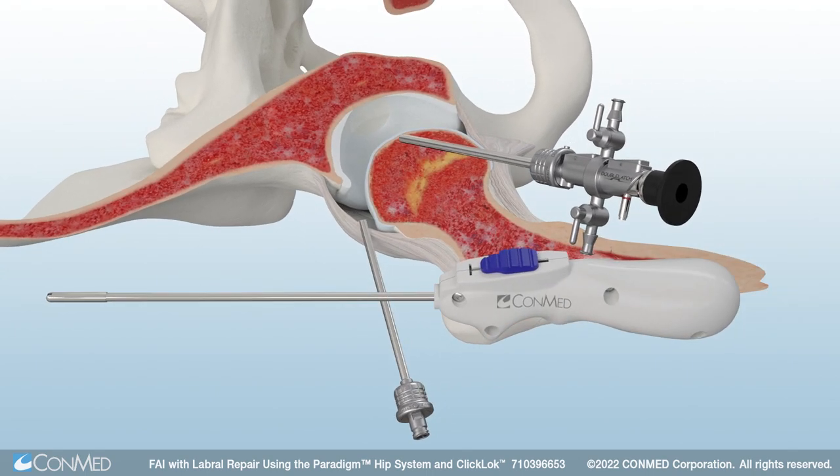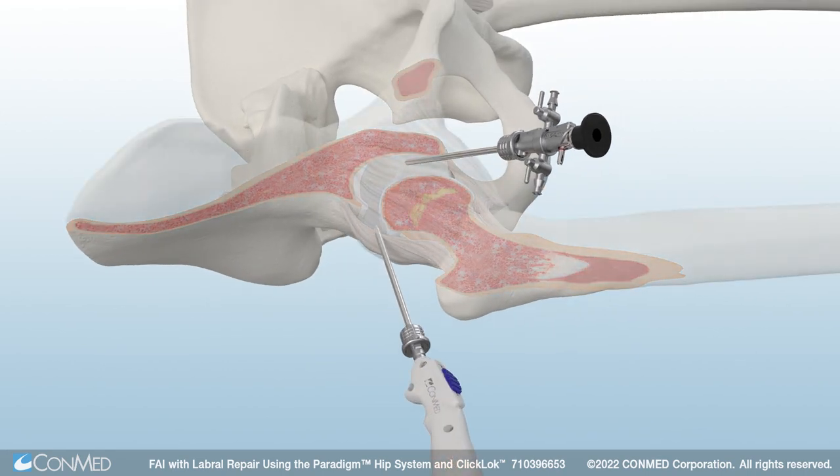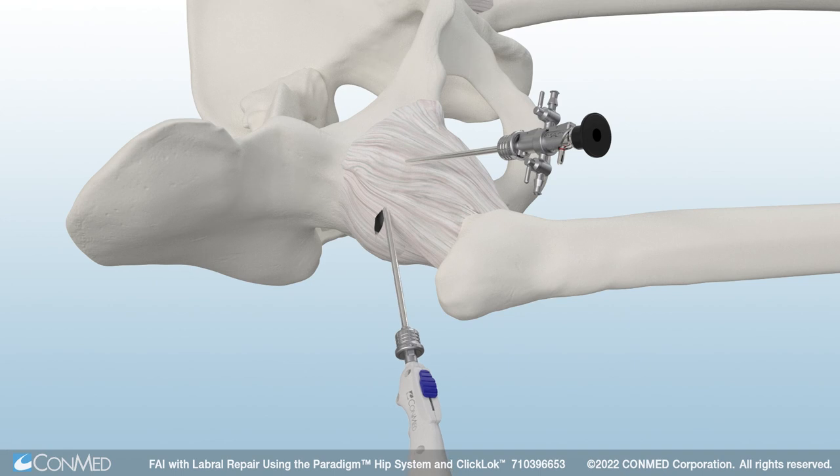Next, use the Paradigm Retractable Straight Blade to cut the hip capsule. This blade features a retractable sheath which allows surgeons to safely probe with the blunt tip and then use the lever on the handle to reveal the sharp blade when it is time to cut. Once the capsule is cut, providing access into the hip joint through the anterolateral portal.